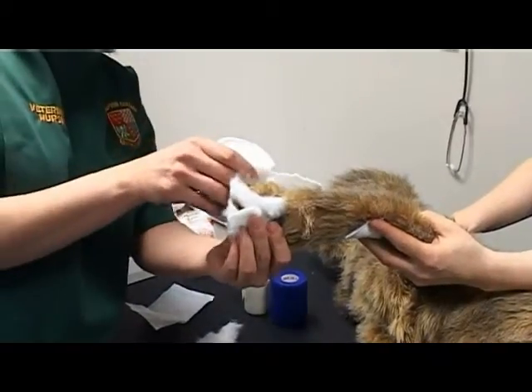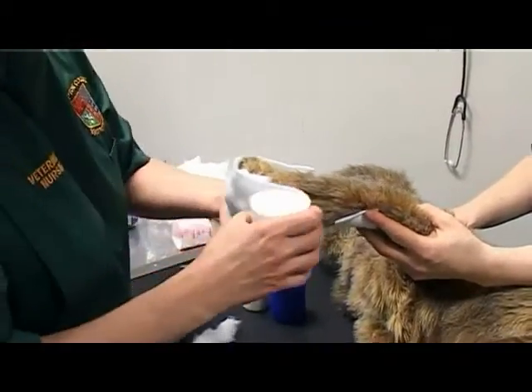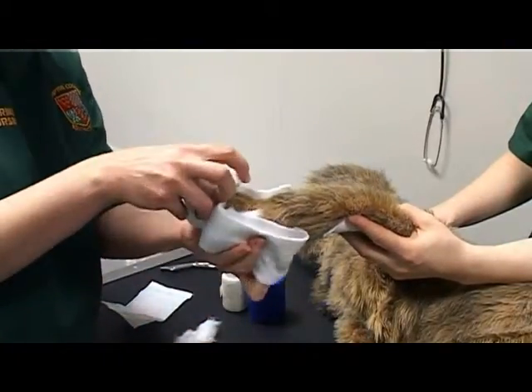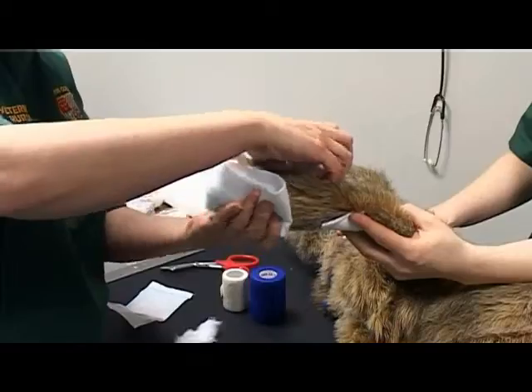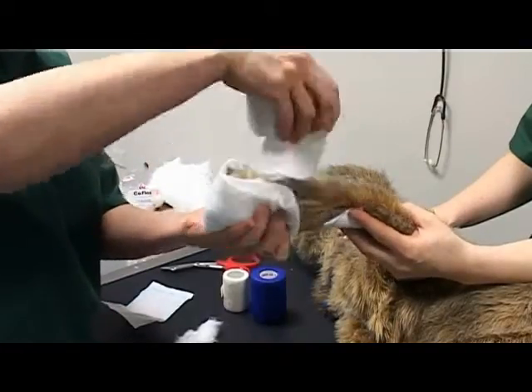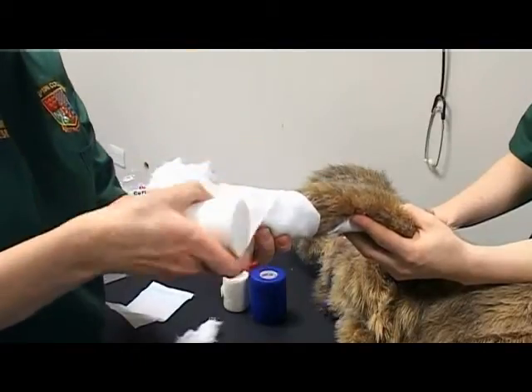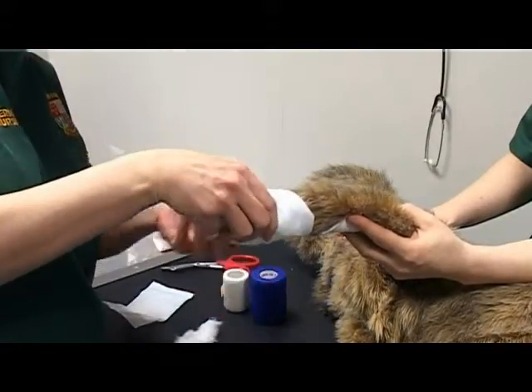Apply a padding layer over the limb, including the foot and elbow. Ensure you are handling the limb gently. Bandage distally to proximally.